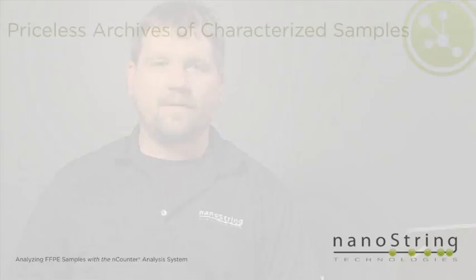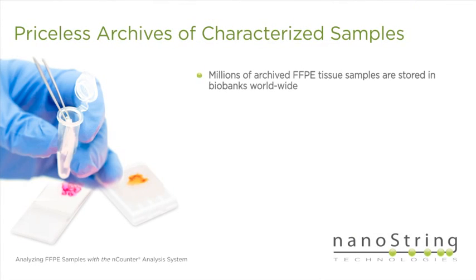FFPE samples represent a priceless resource of characterized samples for the clinical research community. Their value lies in the biochemical and clinical information that is preserved in this unique collection of samples. For example, millions of FFPE tissues are stored in biobanks worldwide. The tissue histology and nucleic acid molecules are largely preserved.